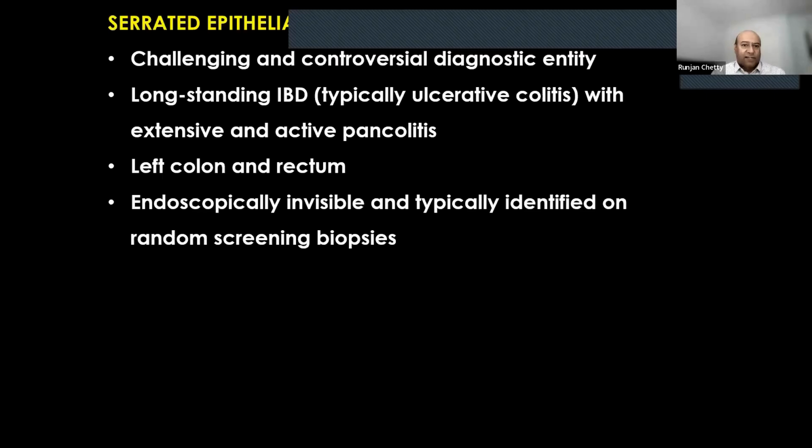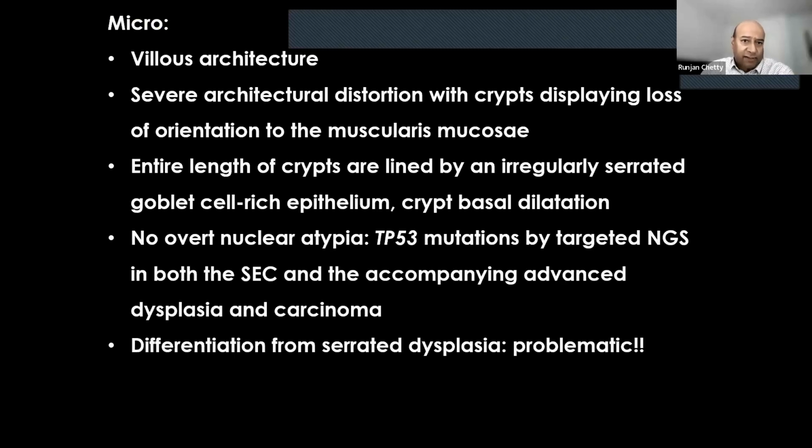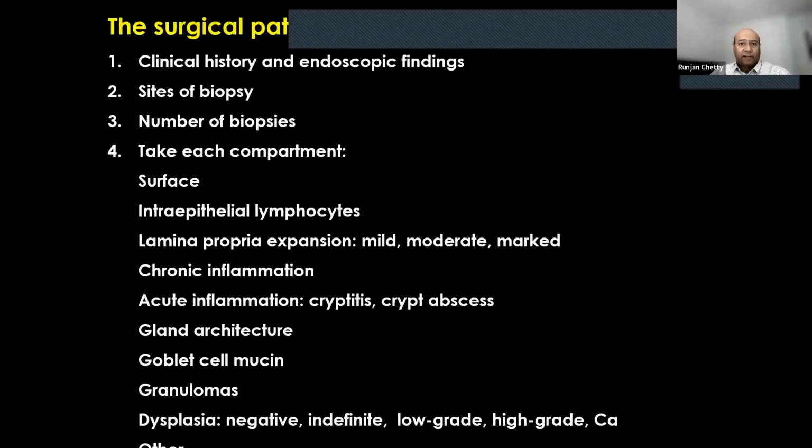Endoscopically, unfortunately, our colleagues can't help us. And it's only when we get to see this under the microscope that we make this call. Again, I think do P53, show it around, and be certain that there is no dysplastic change, and just describe it is my advice. Because later on, obviously, this may be shown to be a dysplastic lesion.